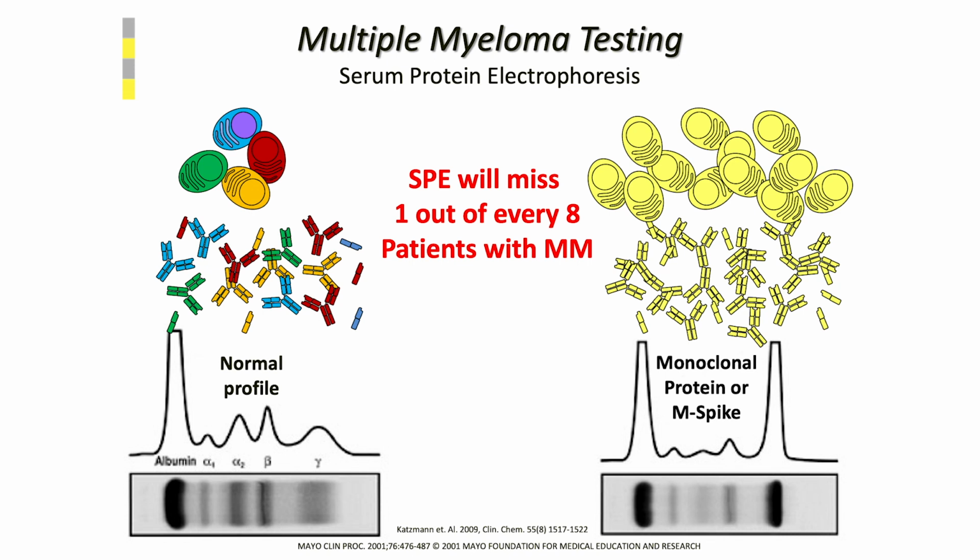What happens then is you end up with a profile. So in a normal person, there's over 200 different proteins in your serum. And each one of these proteins, here's albumin, which is found in very high quantities, you get a band, right? Now we know that immunoglobulins, heavy chains and light chains, happen to be in the high beta region or in the gamma region. So everybody can see the difference between the monoclonal patient here and the normal profile. Notice that the monoclonal protein has a very dark, distinctive single band in the gamma region. And that's because the malignant plasma cells are producing immunoglobulin molecules that are identical. Lots of identical molecules. And so those identical molecules migrate to the same exact position in the gel. Where a normal person has a smear because their immunoglobulin molecules are all slightly different. They're not identical. Does that make sense?